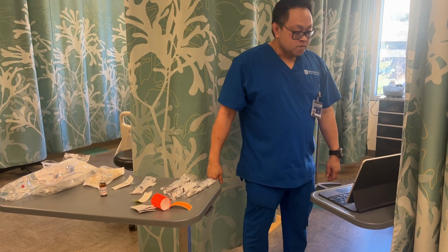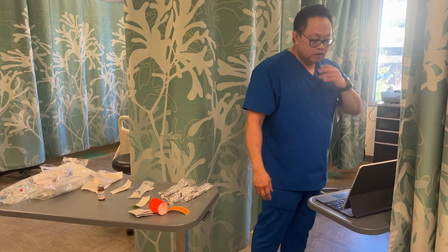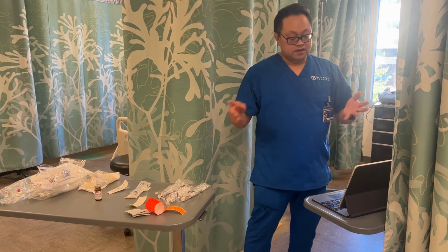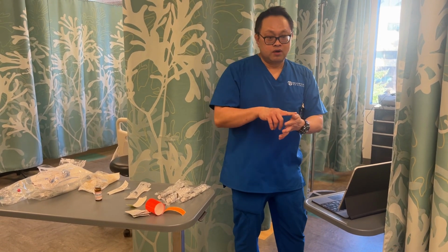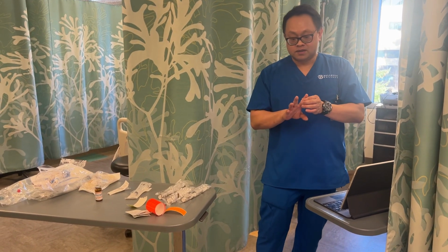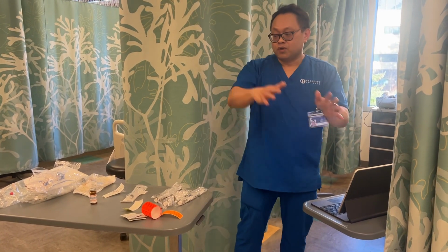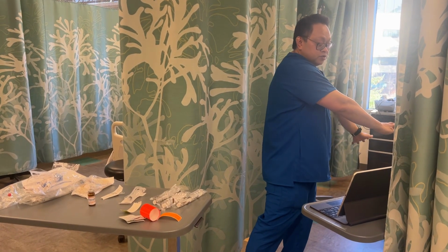Okay. First, I'm going to check the very important things, allergies here, and right before I administer to the client, and then the rights: right medication, right person, right time, right dose, right route, right to refuse, right to document, and again, allergies. I'm going to do it here when I'm gathering my supplies and right before I am administering to the client, right?